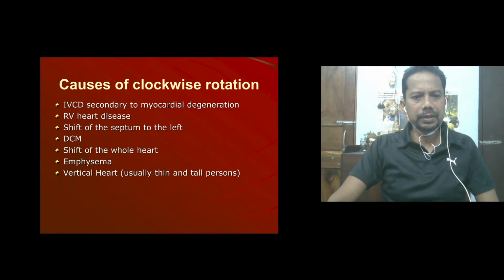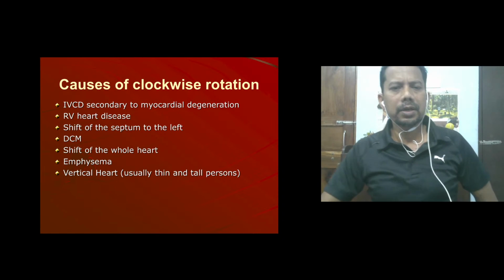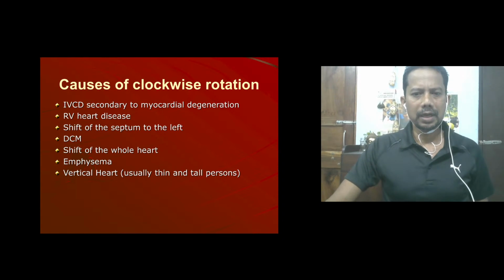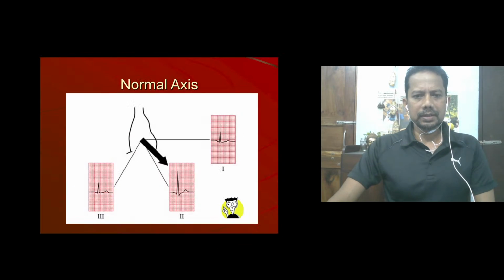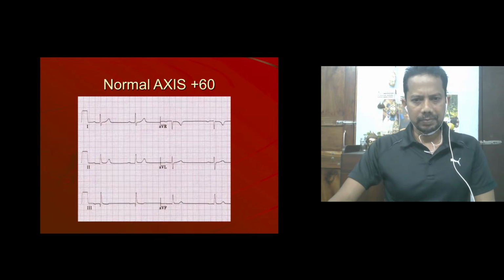So these are different causes. We will not go into these details because we have already discussed them. If you want to see, you can refer to yesterday's live stream, and it is still there on the channel. So always rate, rhythm, axis. Axis we have done. We will not spend time on axis.